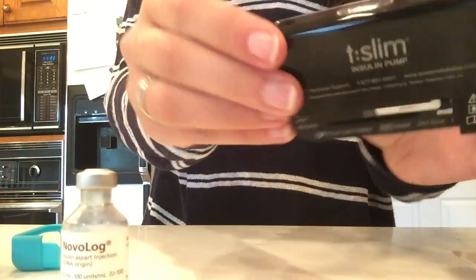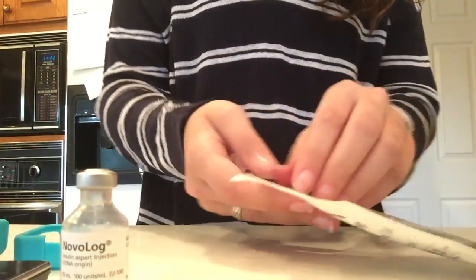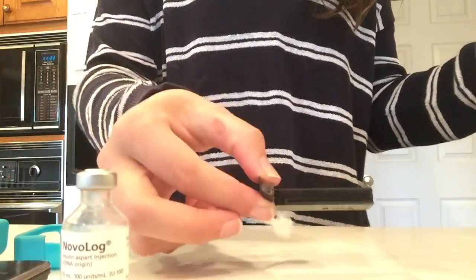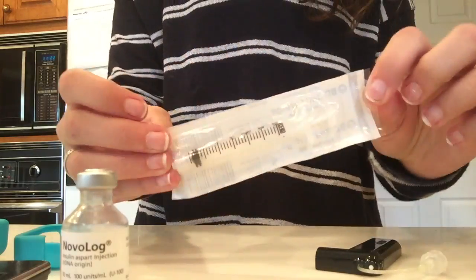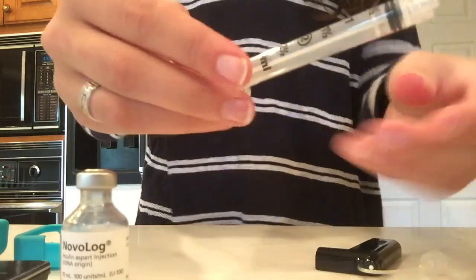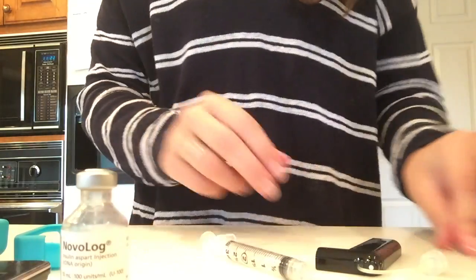That is what it should look like after the cartridge is off. You're going to set your pump aside and open up the cartridge package and take that out — this is what the cartridge looks like. Then you're going to open up the cartridge syringe, which does not have a needle attached to it, but this is what the syringe looks like.